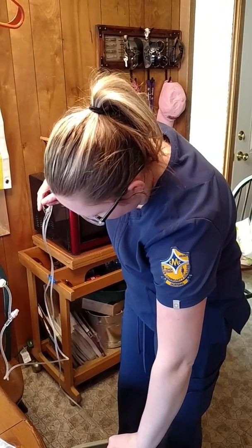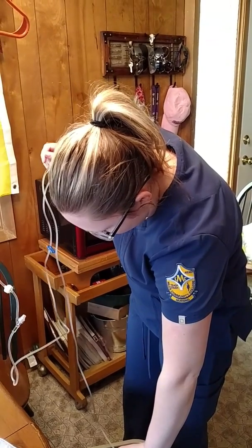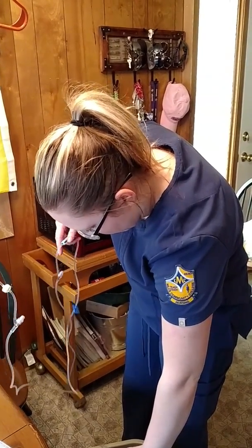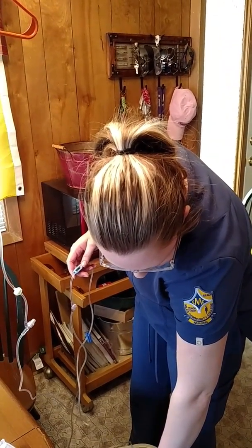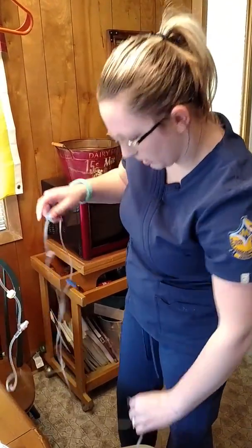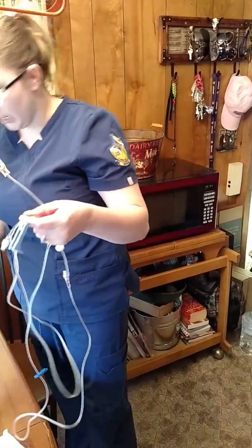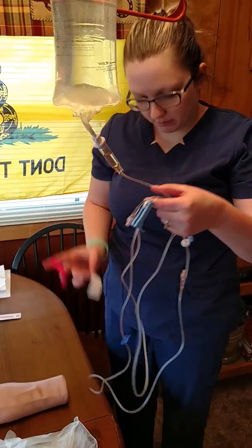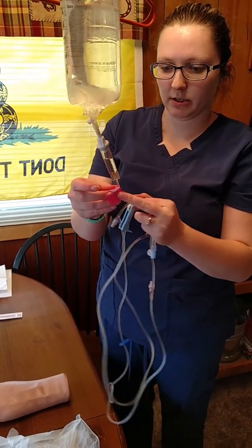We're almost done here. We've got one more air bubble to get out here. Perfect. Alright, so this is all ready to go. And I'm going to go ahead and mark my sticker. We want to change this within 72 hours, so I'll put my information on there when I started it and the date and when it expires, and we need to change it.